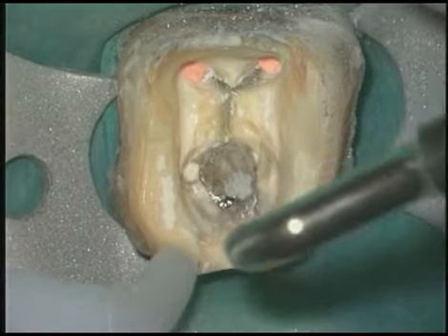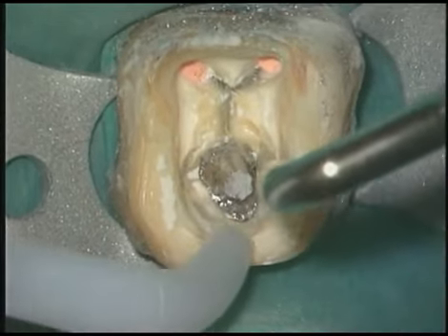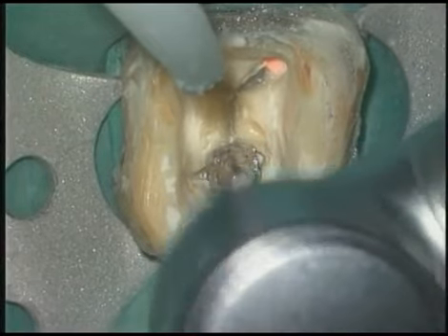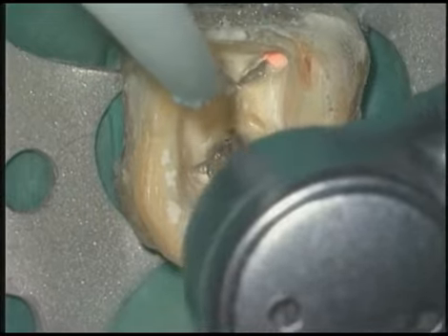The amplitude of the tip is maximized and the energy imparted to the residual cement optimized when ultrasonic instruments are used in a light brush cutting action. This is the RotoPro going around the post in a clockwise manner. Remember, its 6 surfaces form 6 edges that impart considerable energy.